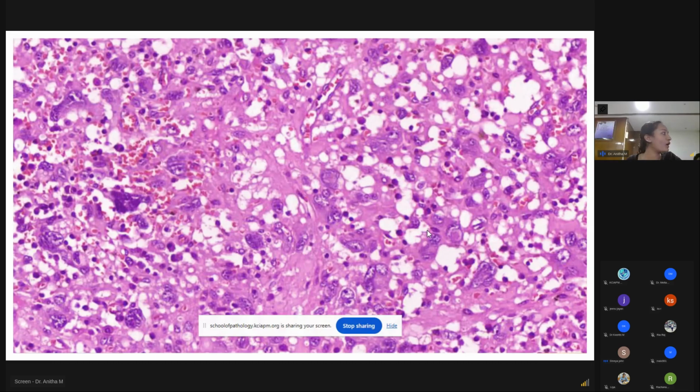Okay, so the tumor did not have any areas of necrosis or mitosis, and it was a very well circumscribed lesion. The DDs that you suggested will be a locally aggressive tumor. It will have varying areas. Yes, ma'am.